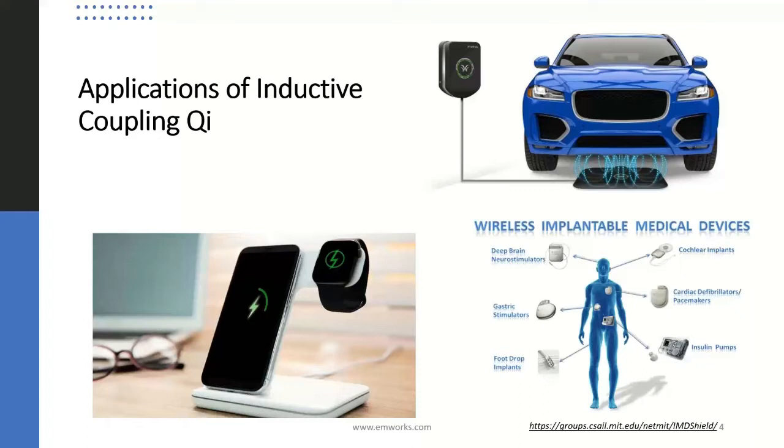It's also used in charging and operating medical implants such as subcutaneous drug supplies, pacemakers, and other implants. Wireless power transfer, especially with high resonance, allows convenient continual charging of these implants without the need for frequent surgery and the inclusion of external charging ports.